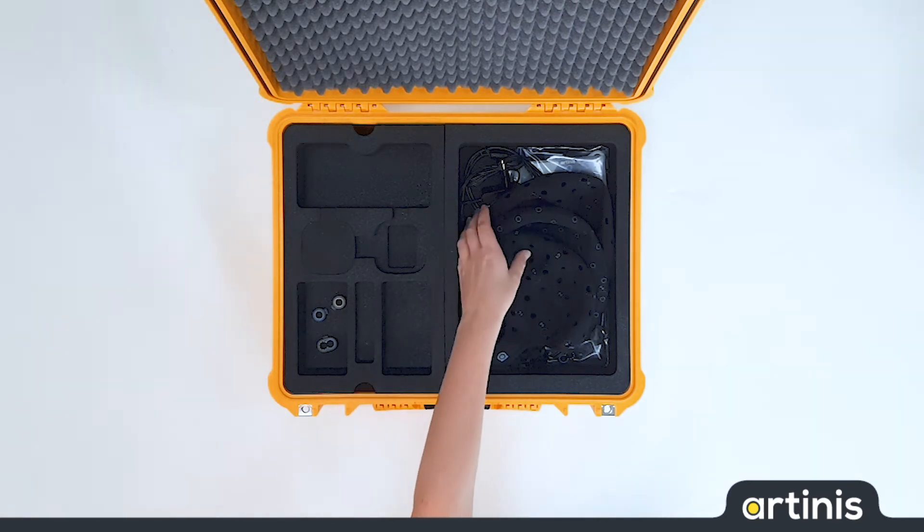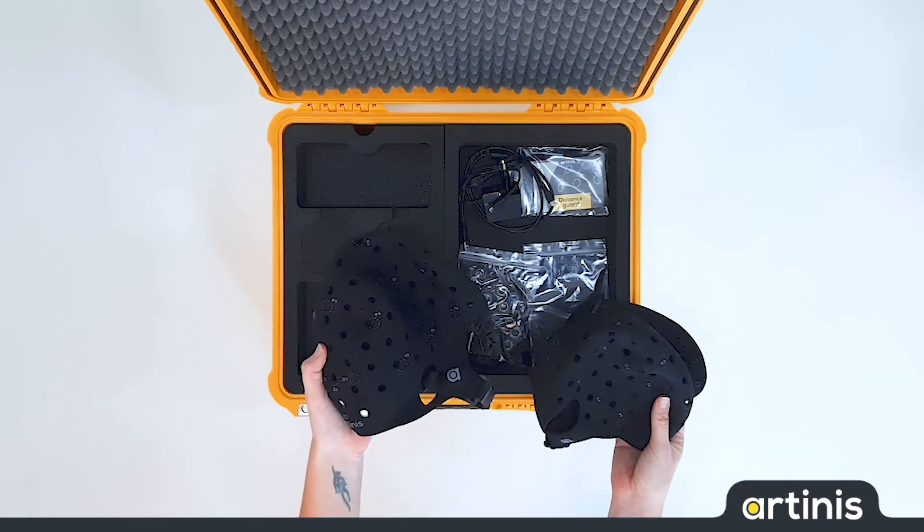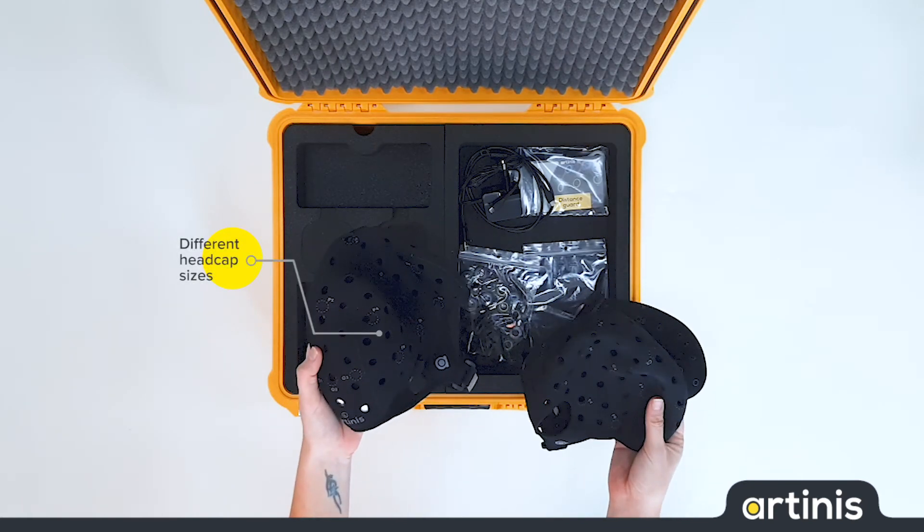With each Bright system we include three head caps. Standardly we include small, medium and large. Other sizes can be included on request.